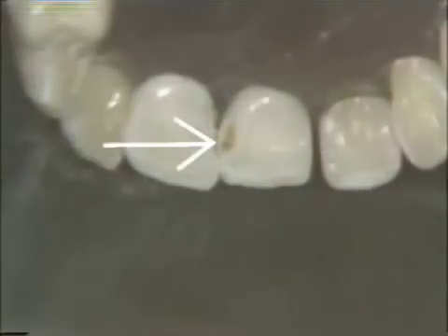Notice with this arrow we are pointing out again decalcification of the labial, and this is of extreme importance to us because it leaves us with a faulty margin if we do not remove it. Looking against the axial wall, you will see there is quite a bit of carious lesion remaining.